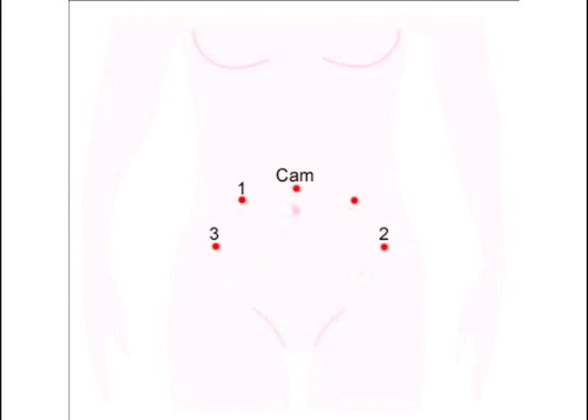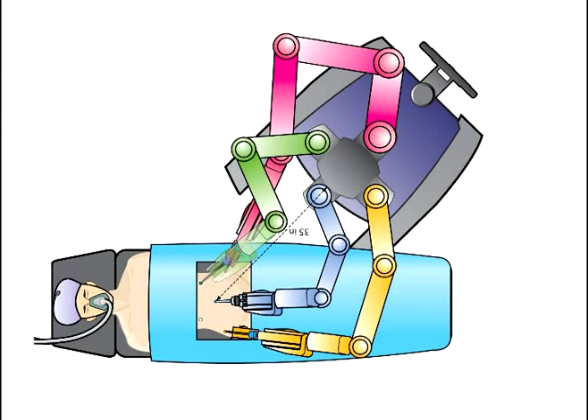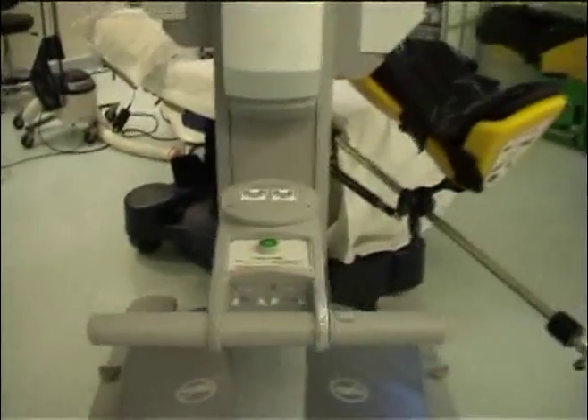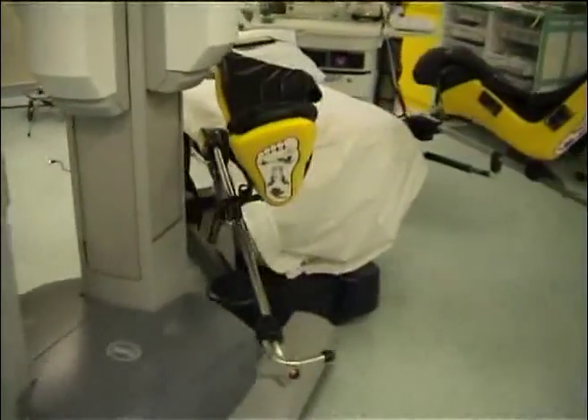The trocars are placed in the traditional way as per between-the-legs docking. This video demonstrates side-docking from the patient's right. This would be used when arm 1 and 3 are on the patient's right. If arm 3 is placed on the patient's left, as illustrated here, then side-docking would take place on the opposite side, as shown here. The robot cart is pushed at an angle of 45 degrees from the midline, with the central column of the robot cart and the camera arm in line with the contralateral shoulder.